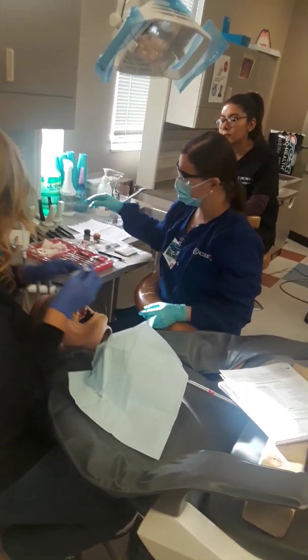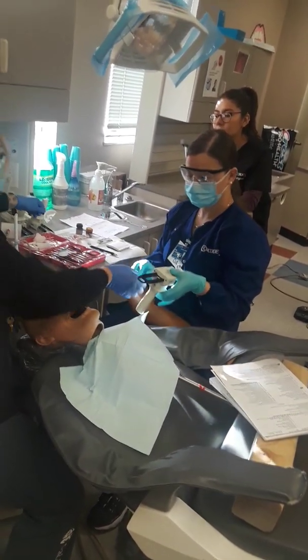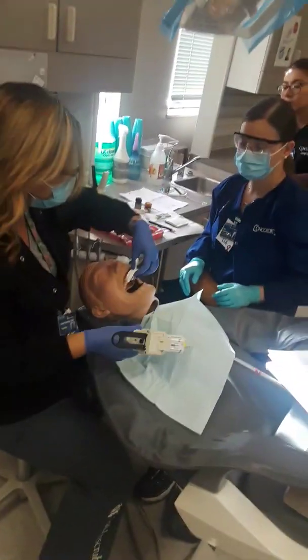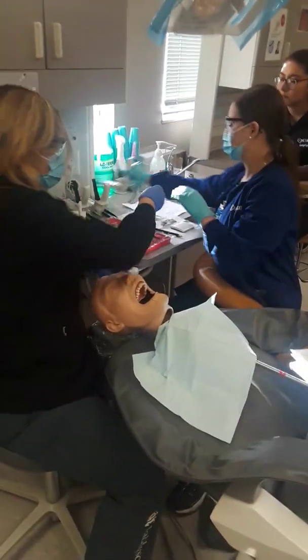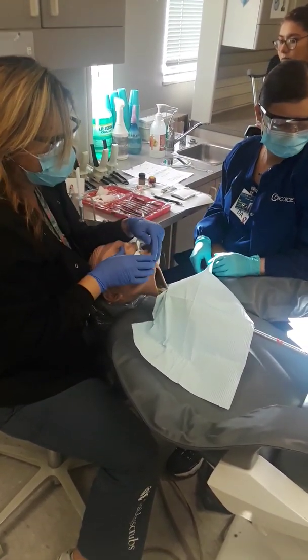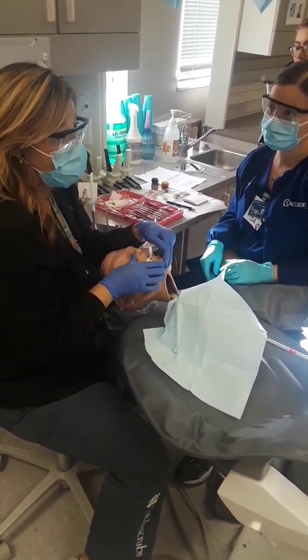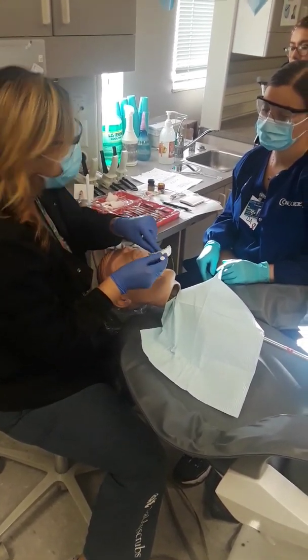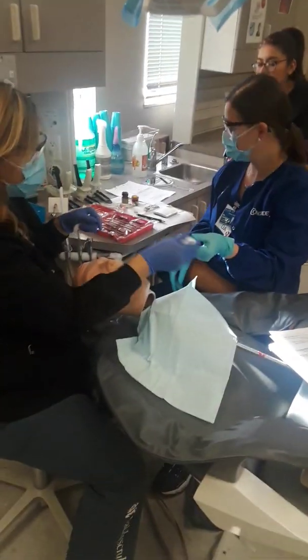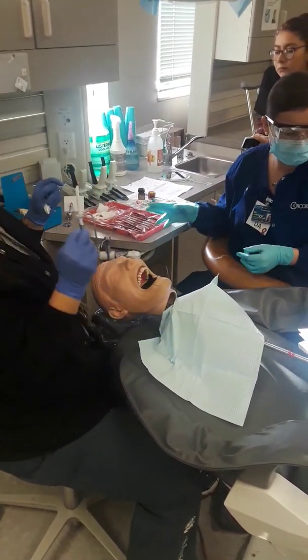But you're going to pass the bite material, and then you'll squirt it on a tray. This material only takes 60 seconds to get hard in the mouth. So we'll squirt it on the tray, put it in the patient's mouth, and take a preliminary impression. Please write prelim, because there's another P word we use, and that's provisional. Provisional is AKA crown or temporary crown, and prelim is prior to, or before, we prep. Okay, so we're going to take our prelim so we can fabricate our temporary crown from. So we have a prelim.